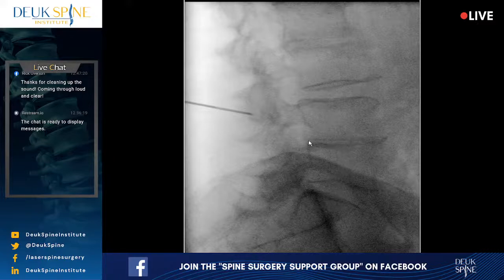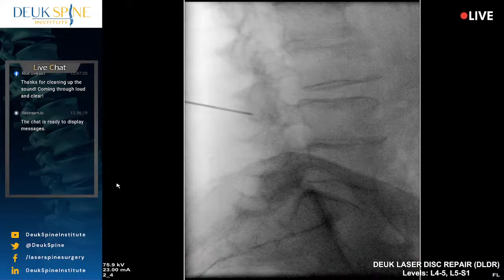That's actually fused. She had surgery done by another doctor. He fused her without even putting a cage in. And you know, the problem is when you look at those bones, there's no curve between them, no curve backwards. We call that a flat back deformity, when it's just straight. So because of that, the disc above and below get extra stress, and that causes them to wear out.